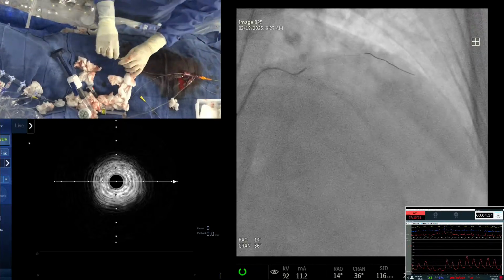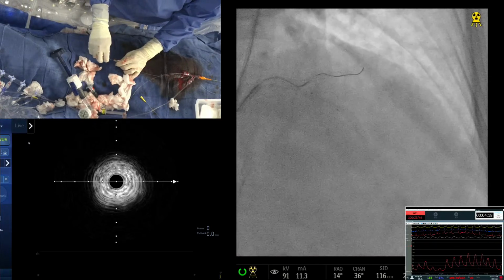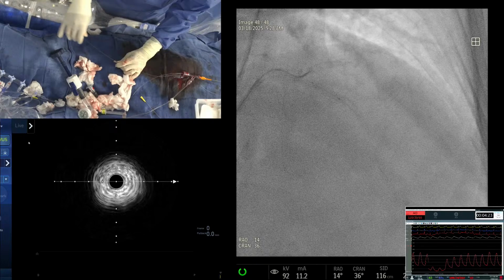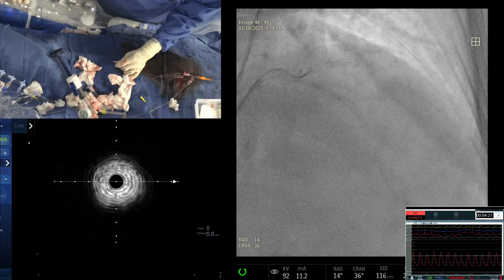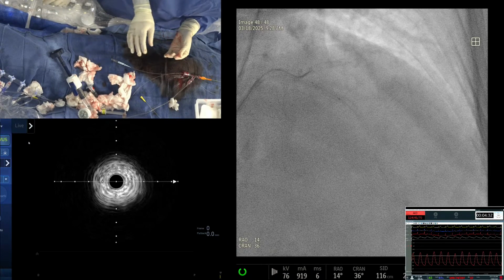Now your balloon will go one side. Yeah, no, you have a funny balloon. They got a new special balloon now. So what is the name? Takayu? No, that's a balloon that did not go. That Takaru? Yes. Your funny balloon can go back.